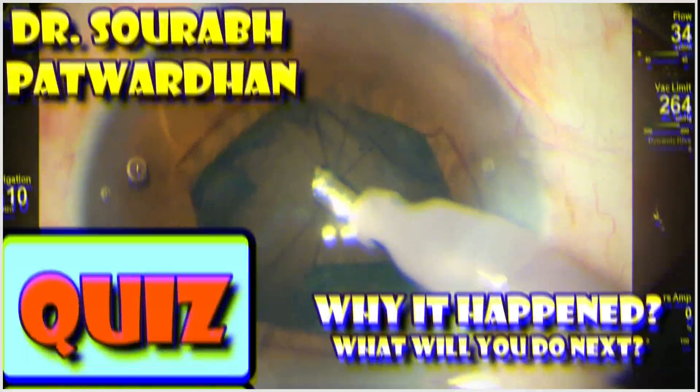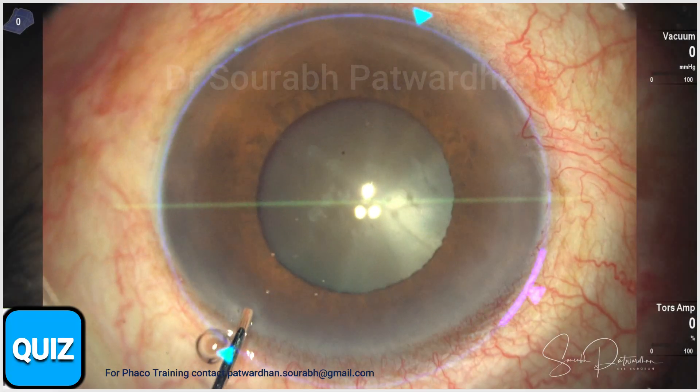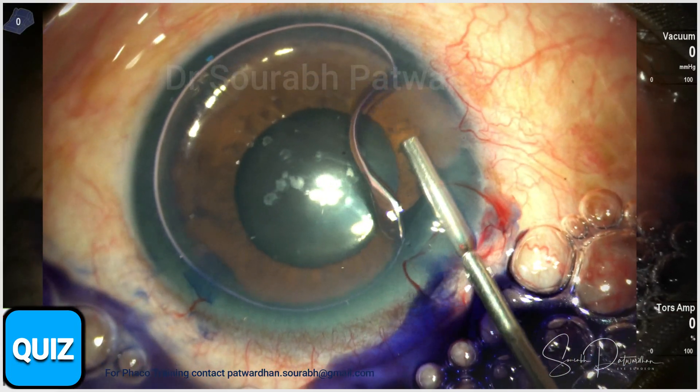Hello friends. I think this is the moment that will test you as a surgeon. This is a quiz about why it happened and what you will do differently for such cases.